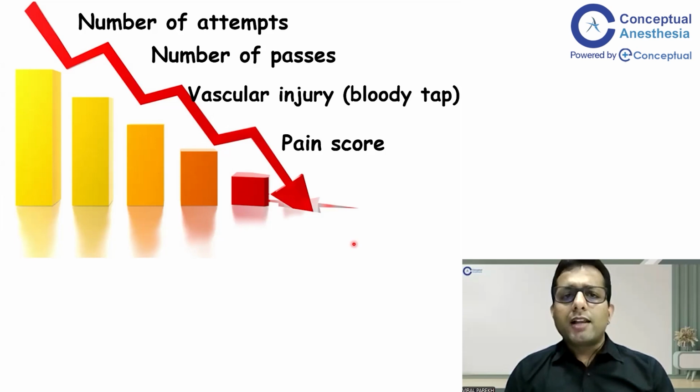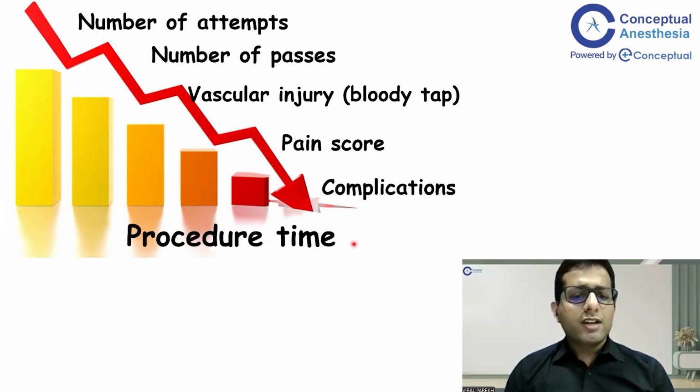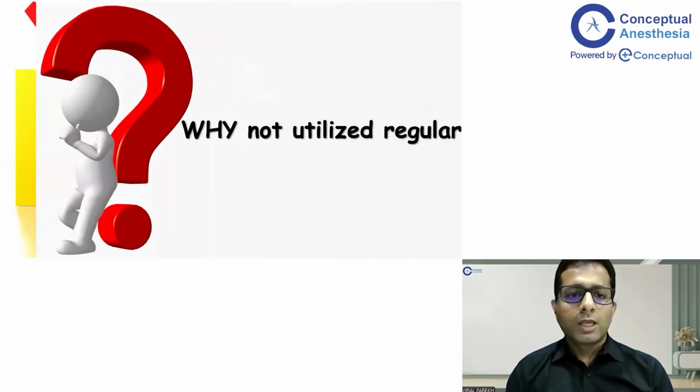It also shows that with the help of ultrasound, there is a reduced pain score in patients. There are fewer complications and improved patient satisfaction. About the procedural time, yes, at the start, when you start performing the ultrasound guided spinal or epidural, definitely it has a higher learning curve. So you might take more time in the beginning. But when you compare over a period of time, the outcome in the end result is definitely better and the procedural time also comes down.